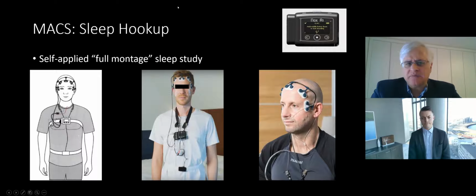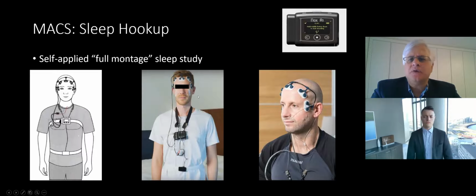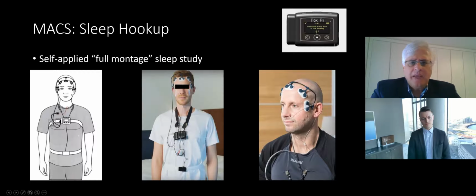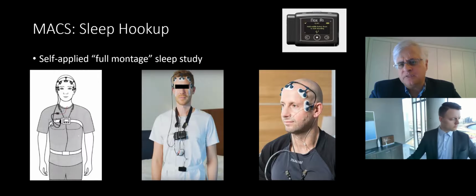The unique aspect of this is that concept of self-applied. Now, why is it self-applied? The reason it's self-applied is this innovative cable, and there are different variations of this in this slide. What you notice is that there's a cable that goes from the monitor itself to the frontal area. And the convenience of the frontal montage is that a participant can put the electrodes on by looking in a mirror and place them very carefully and without much discomfort or difficulty.